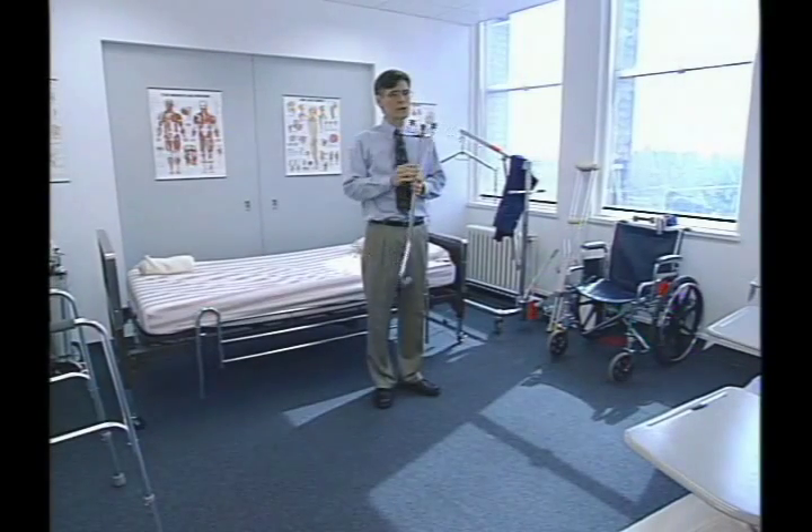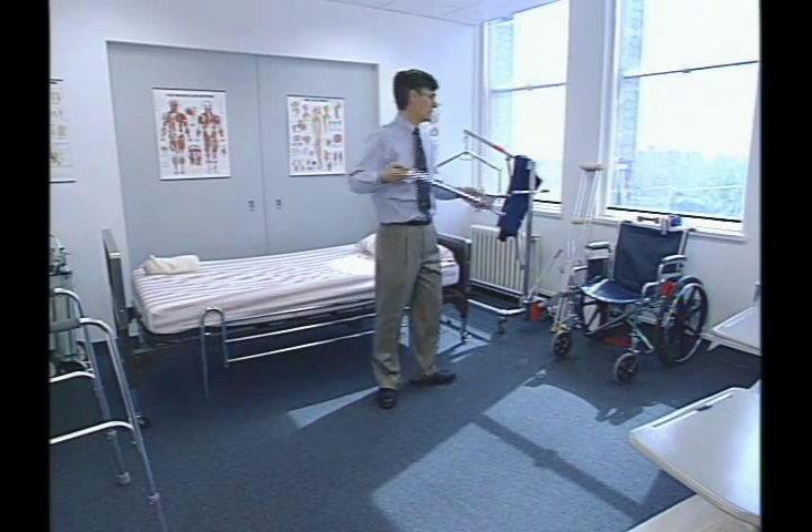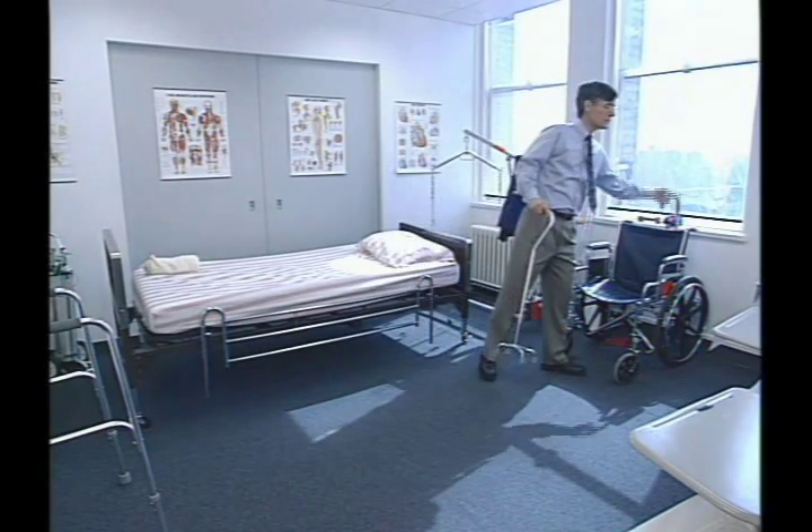This is a small-based quad cane. Usually they're twice as large. It gives quite a bit more support than a regular straight cane.